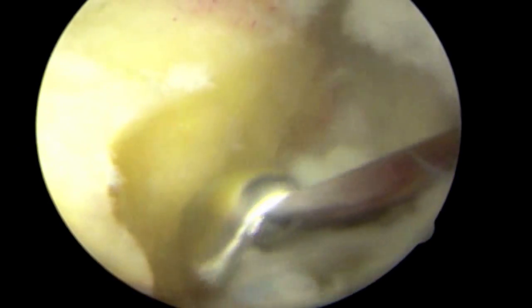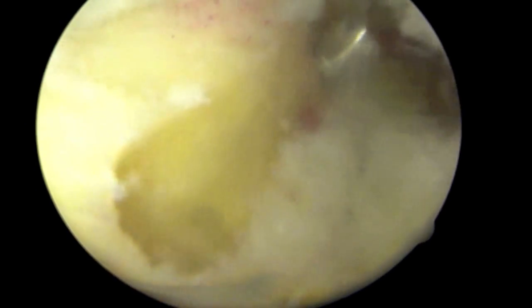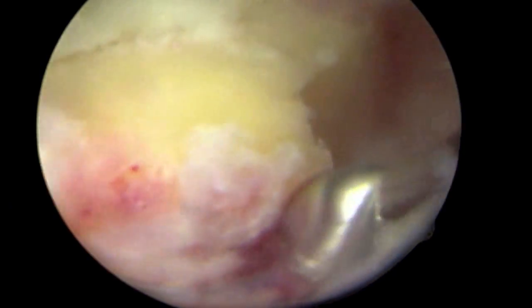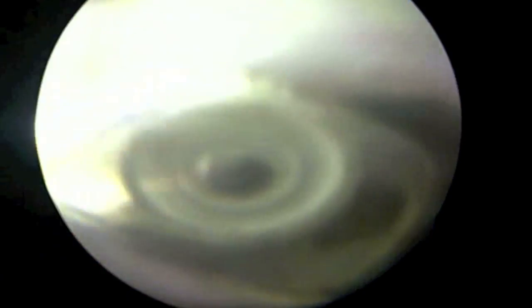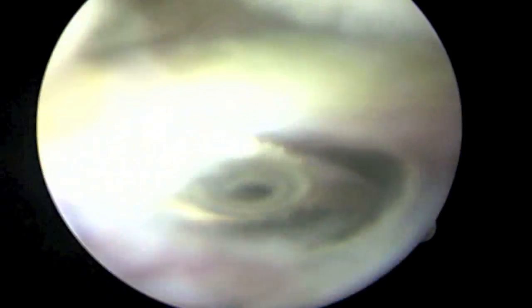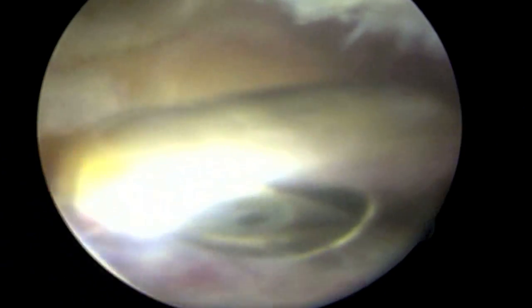This is done through a minimally invasive technique, and in this patient, two small incisions measuring approximately one centimeter in length. It is done in saline fluid, which allows for the work to be done without overheating the instruments or the tissue being removed. The saline is essentially a form of water which reproduces the normal salt levels we have in our human body.